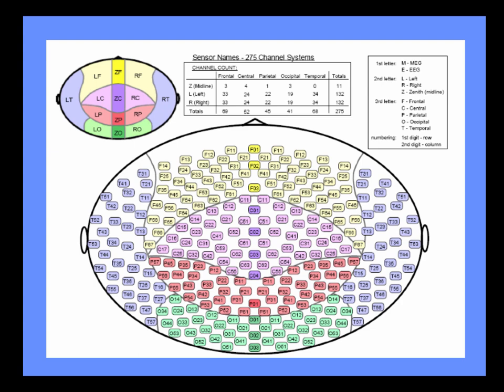The thing that's very important to remember about axial gradiometers is that, if you pick a particular channel, like F13, the signal that it's picking up is in a circular array around it. The signal right underneath the axial gradiometer, it doesn't really pick up. It picks up a signal from around it. So you can't read this in the same way that you would read an EEG, saying, oh, gee, if I see a big signal at one of these leads, the signal's underneath it. It's not at all the case. It has to be processed, and I'll tell you a little bit more about that.